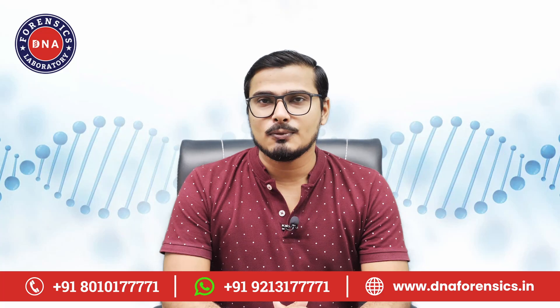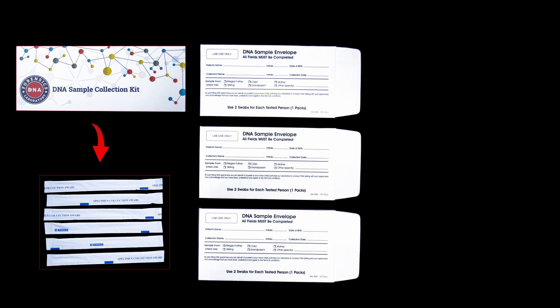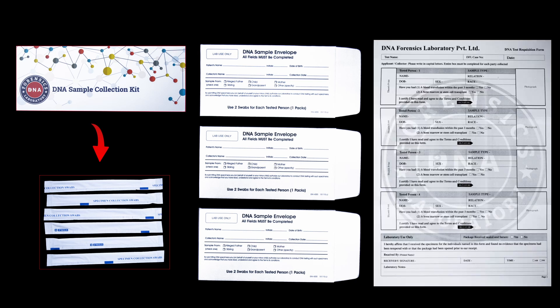The kit contains material for sample collection of up to three people. So you get six buccal swabs — that is two swabs for each tested person — three envelopes to put each tested person's samples in, and most importantly a consent form in which you have to fill all the details of all the tested persons.